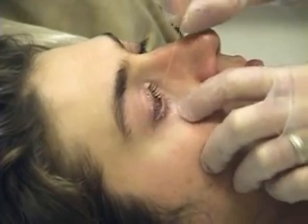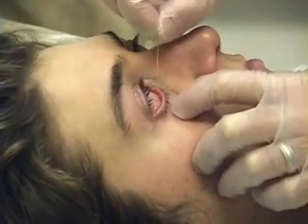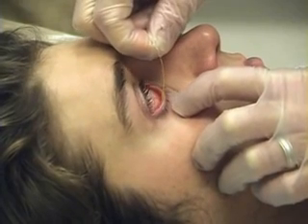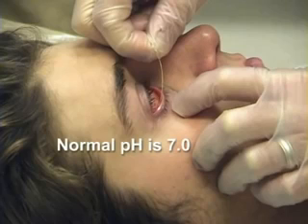Check the pH of the eye prior to irrigation by placing a piece of pH paper in the inferior fornix. Normal pH of the eye is 7.0.